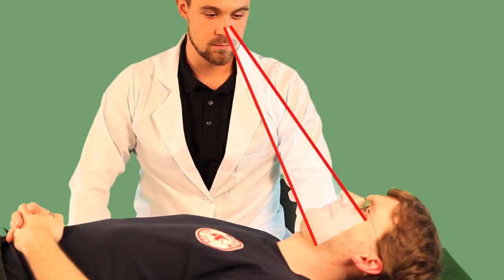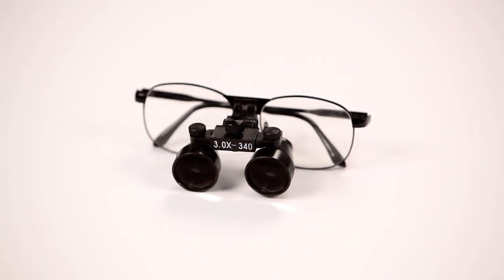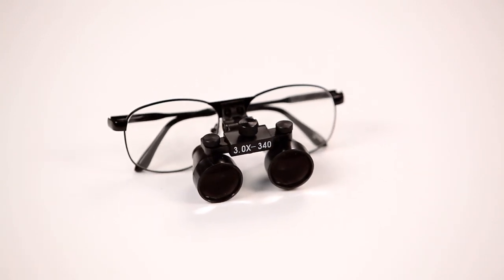You will use this measurement to determine the size of your dental loupes. Now the next thing you'll want to consider is the magnification. This will affect your depth of field and field of view. So choose wisely.